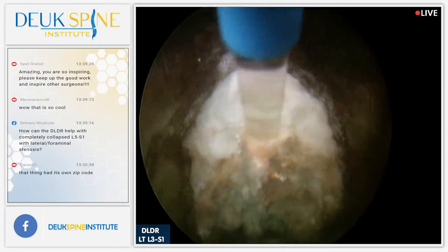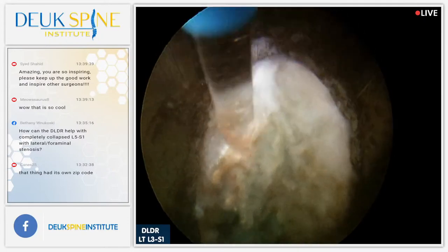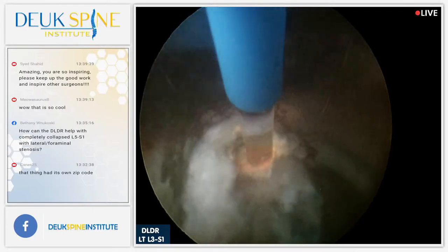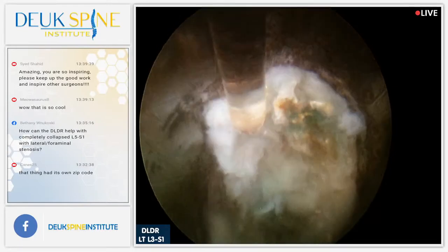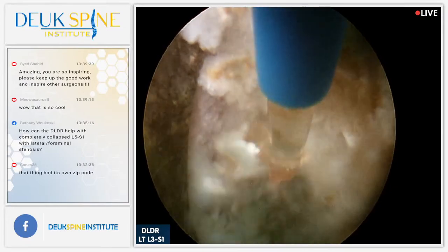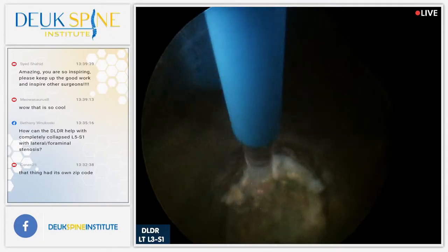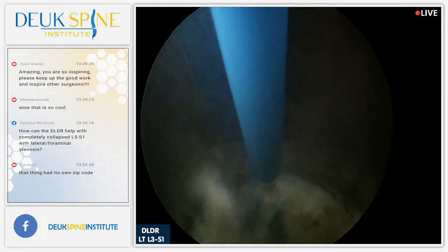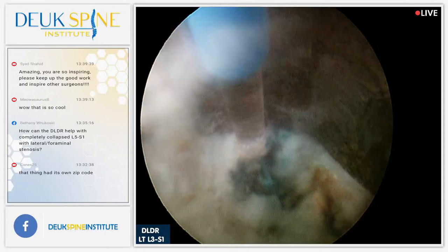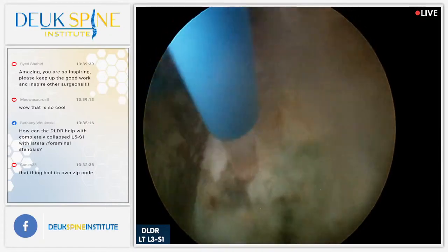You guys see the blue tear right there? That is the annular tear. It's the whole reason we're here, to get rid of that. All right, if there's questions, I will take them. No current questions. Let me know when you need my help. You doing all right, Bernadette? Let me know if you have more questions, Henry. Copy that.